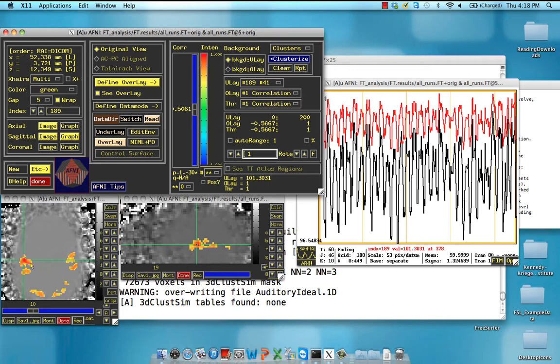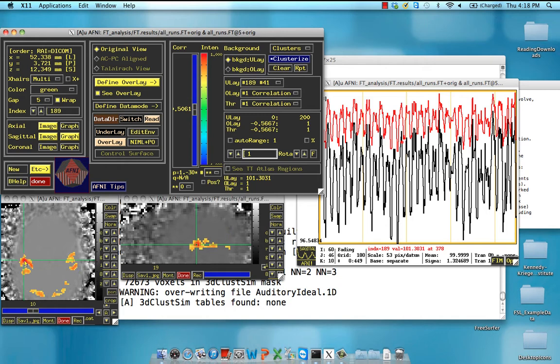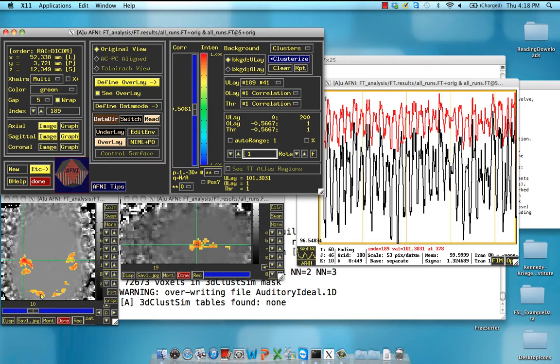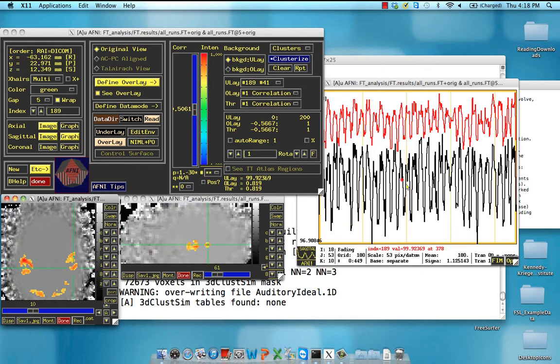And so this is what a Functional Connectivity Map looks like. So if I click on any other voxel which has a very high correlation with this seed voxel, you're going to see a time series that looks very similar to what we just put in there. So let's say I click over here. And also, not surprisingly, we see high degrees of correlation between that and the bilateral area in the other part of the auditory cortex on the other side of the brain. And also with some visual areas because it was a visual and auditory task. There were both components involved. So if I click over here and I look at the time course, it also looks very similar.